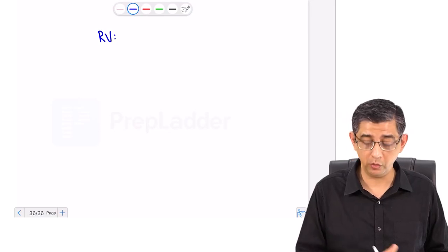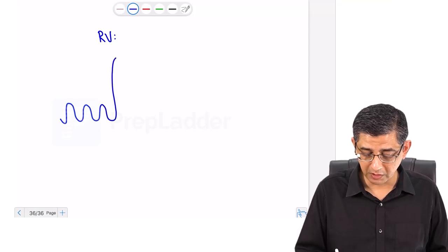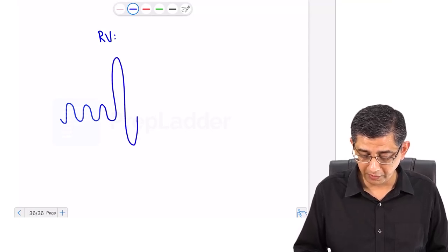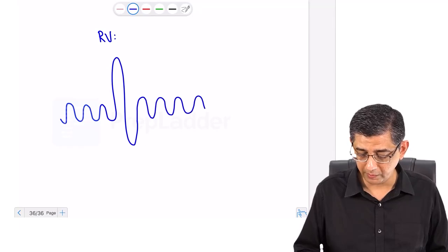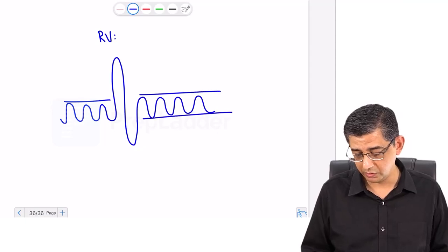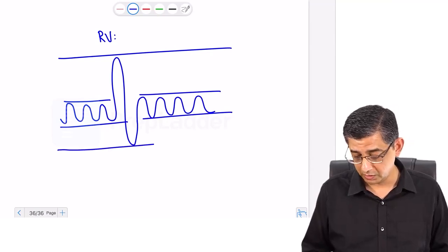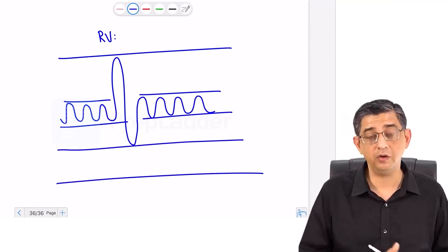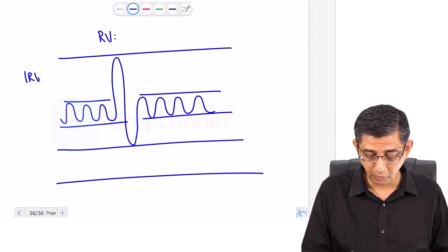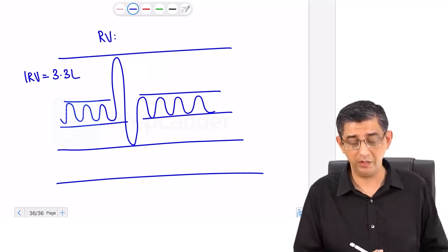At this juncture, since I spoke about residual volume also, I think it's very clear that whenever you follow the spirometric curve, residual volume cannot be measured by spirometry. It is always extrapolated, no? If I draw a routine curve, like I'm drawing at the moment, you guys can pick up the routine values, and I don't think you need to draw them. You can just listen to me here. From the current sketch, you definitely can push more air into the lungs; inspiratory reserve volume would go up to 3.3 liters in a healthy adult male.